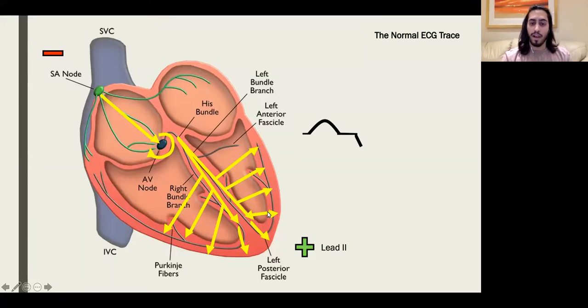All the electrical potential is going down here all the way to these walls of the myocardium, okay? When all of the potential goes over there, you can kind of argue that there's no real direction to where this is going. What will the actual deflection look like on this ECG? What will the graphical representation of this depolarization be?